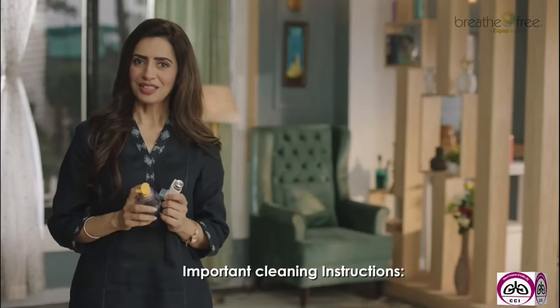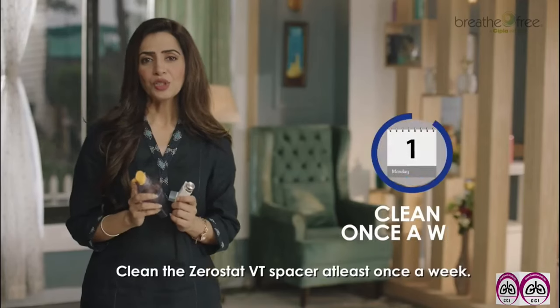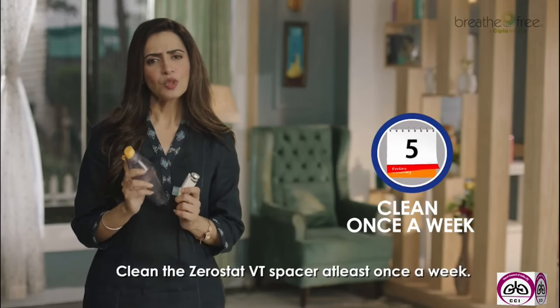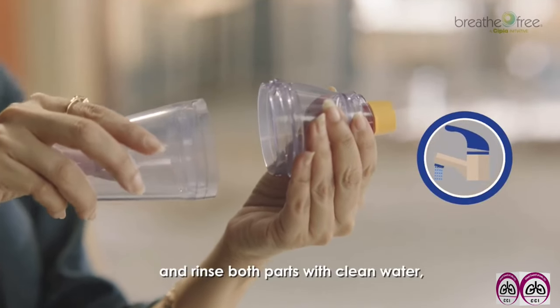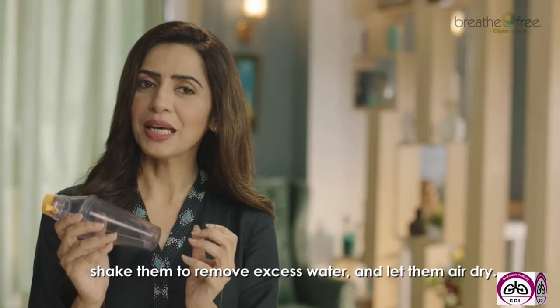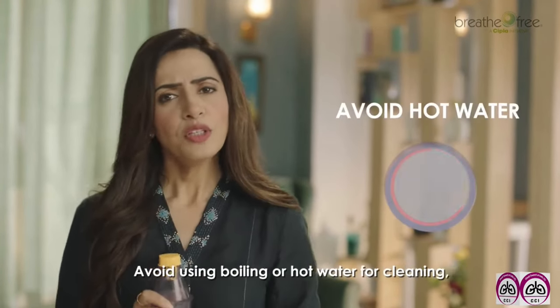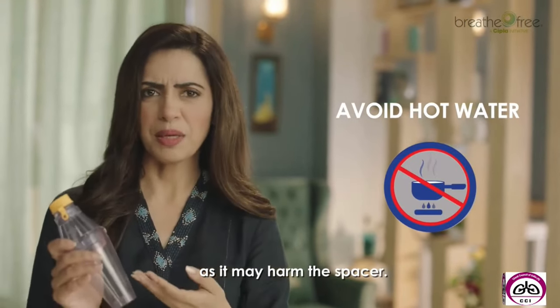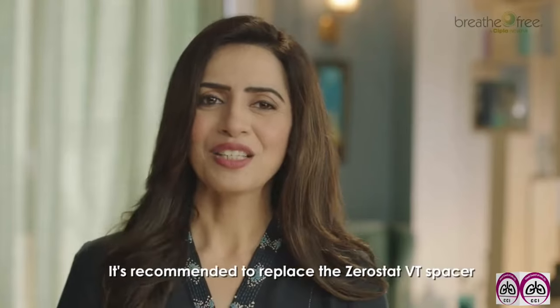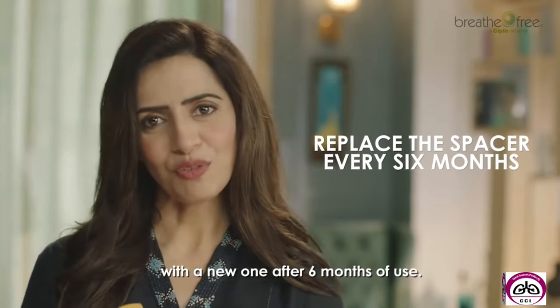Important cleaning instructions. Clean the Zerostat VT spacer at least once a week. Separate the two parts of the spacer and rinse them with clean water. Shake them to remove excess water and let them air dry. Avoid using boiling or hot water for cleaning as it may harm the spacer. It's recommended to replace the Zerostat VT spacer with a new one after 6 months of use.